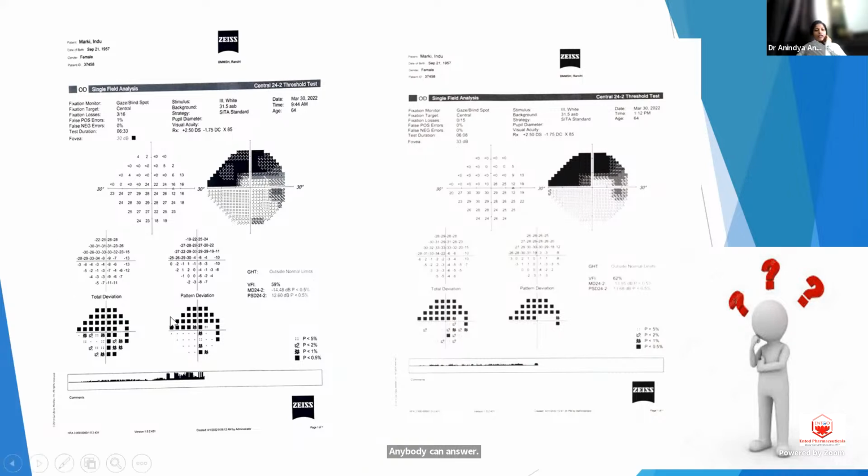Okay. In the first visual field, on the lower side of the visual field, you will see there are a few points where there is depression. But here there are no such points. The lower quadrant is completely normal. Every point is fine. And it is on the same date that the visual field is done, right? So it's not that the patient had a defect and is now improving. It's actually a learning curve. Hence, whenever there is a doubt that the patient is progressing, you must do visual field twice. Especially for the first baseline, you must do it twice to confirm that you have received a reliable visual field.